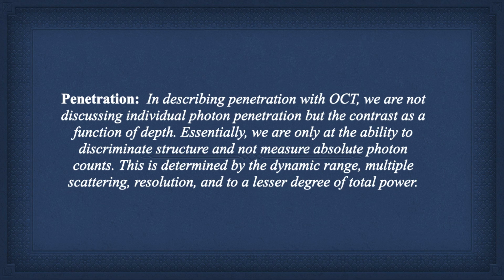So penetration isn't how far photons get into the tissue. Penetration is how deep we can image structure, and it depends on the dynamic range, multiple scattering, which was explained in a previous lecture, resolution, which should be the same for both, and to a lesser degree, total power.